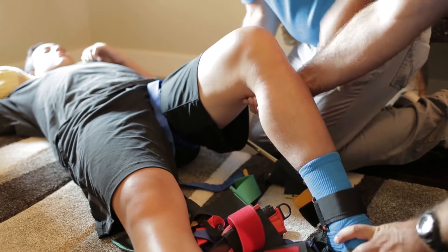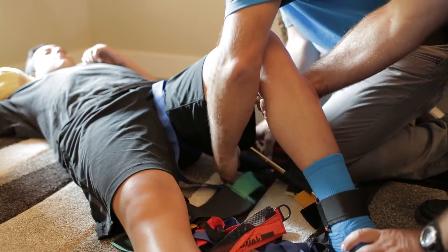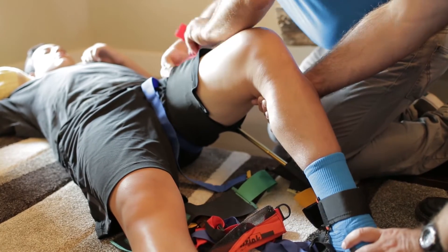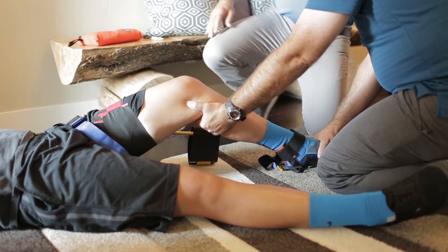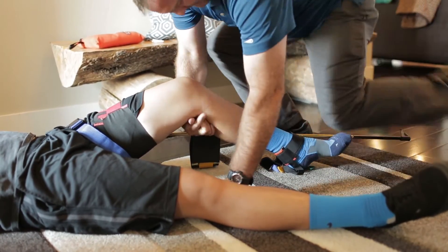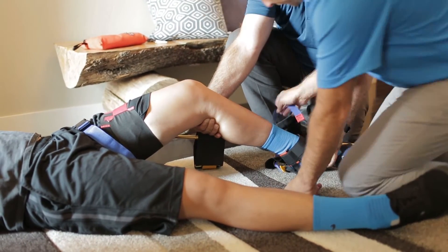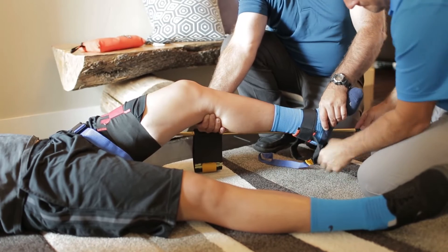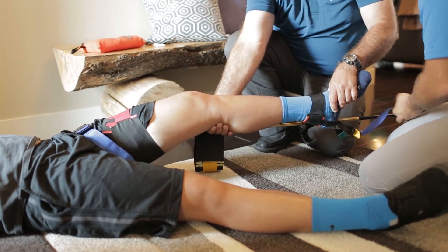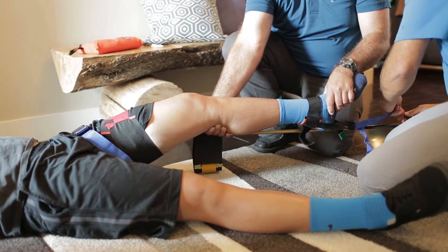We put the ankle strap on. At this point I'm going to put the red strap around the top of the thigh. The only time we want to do this is if it's a mid-bone or mid-shaft fracture. We don't want to do this if the fracture is within two inches of the knee or up in the hip — this is for a center-of-the-thigh fracture. Now I come down and put the yellow part of my strap onto the black end, then pull the red side.